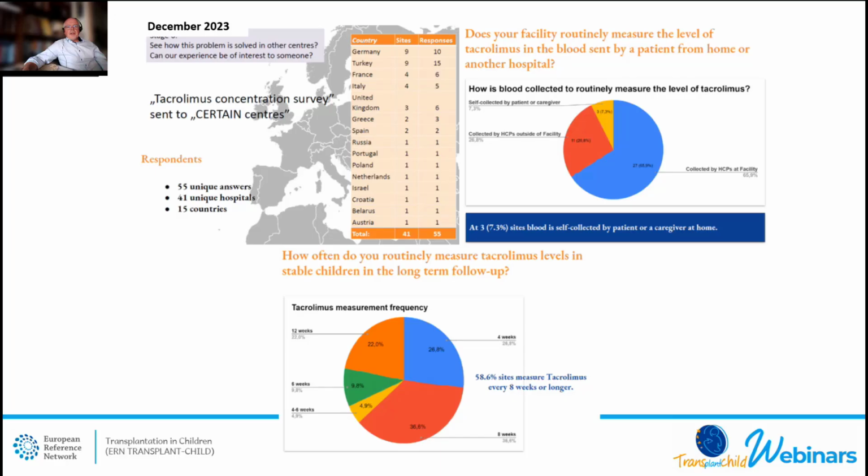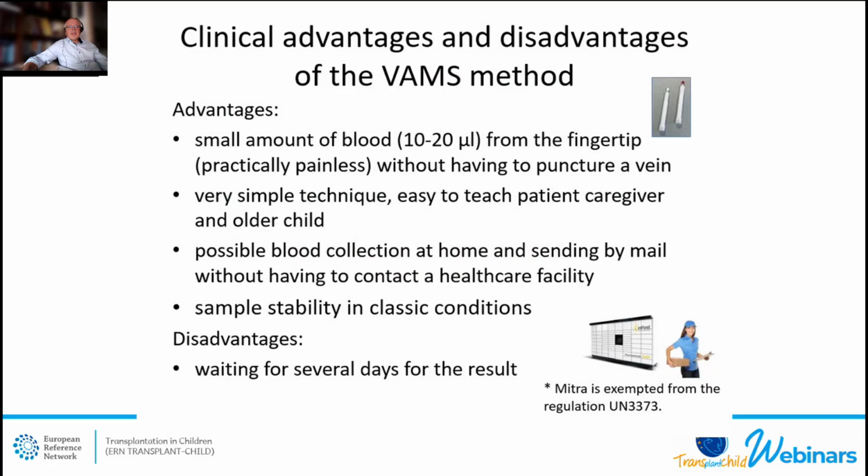So in my opinion, there are a lot of clinical advantages of the VAMS method. The first is that a very small amount of blood is needed, without puncturing a vein. The technique is very simple, easy to teach to the patient, caregiver, and even older child. There was no situation in which patients or parents couldn't be taught this technique.